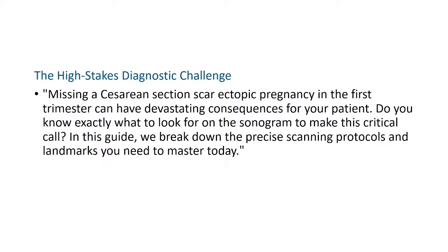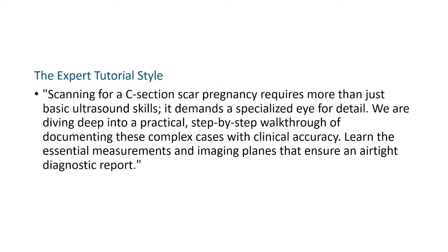Some of you are already competent, and I wouldn't take the credit from you, but for educational purposes, some of you are not yet competent, and refreshing and adding pieces of knowledge is always critical and vital. Scanning for a scar pregnancy requires more than just basic ultrasound skills. It demands a specialized eye for detail.